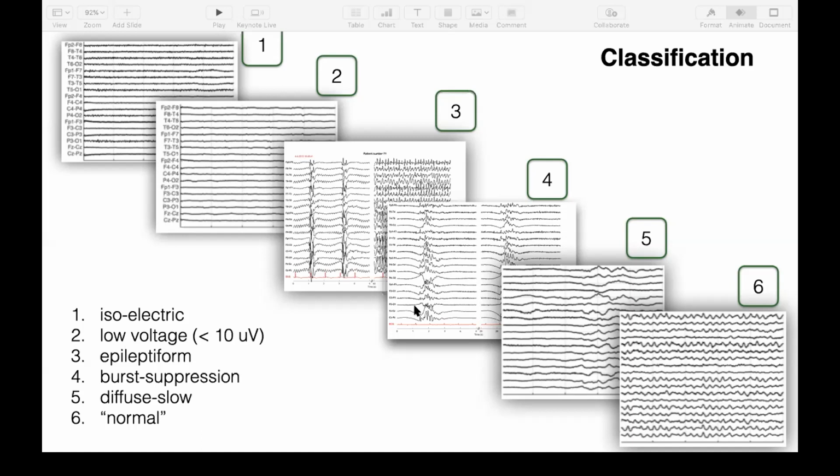I refer you to the literature, but if we keep this particular classification in mind, we can identify about 50% of the patients, either with a good or a poor outcome within 24 hours or up to 24 hours after cardiac arrest, which is a tremendous increase as compared to about 7-8 years ago, where the only test that we had for prognostication was the somatosensory evoked potential that assisted us in identification of patients who did poorly with a sensitivity of approximately 30%.